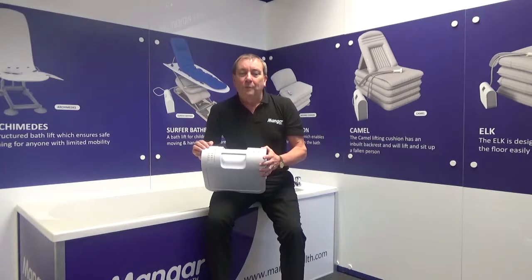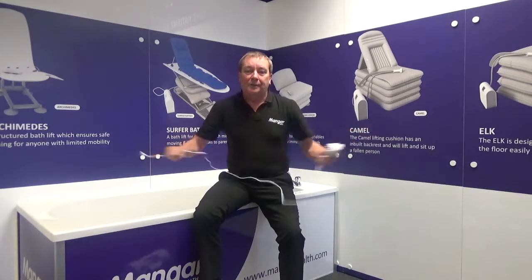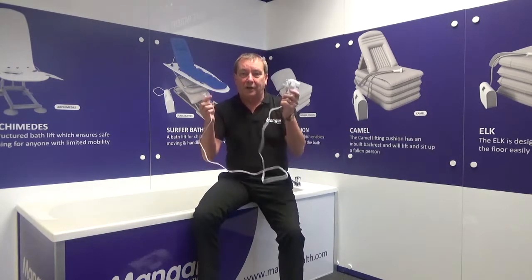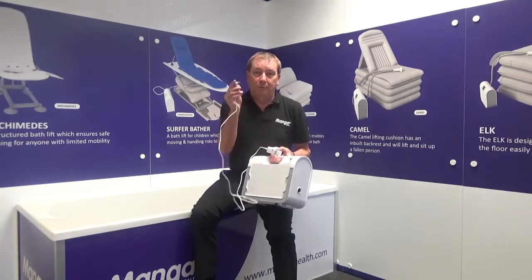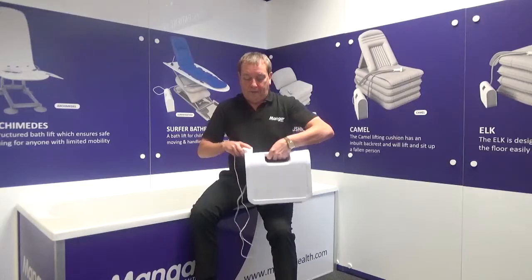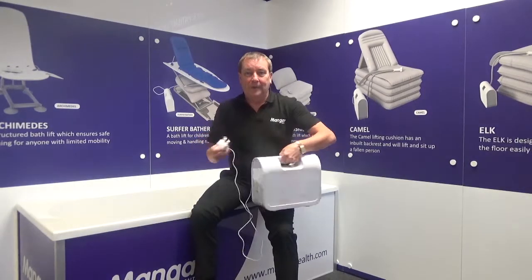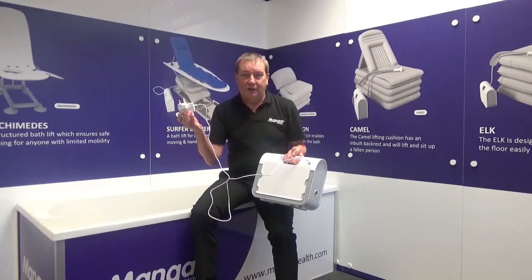But what do we do when we first receive the unit from the supplier? The first thing we need to do is put the compressor on to charge. When you receive your compressor you will also receive a charger. The charger connects to the compressor with a simple plug, which fits at the back of the battery light indicator button. You can then plug the charger into the mains and we're ready to charge.